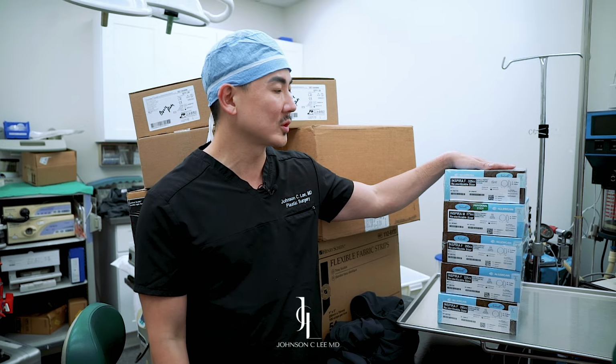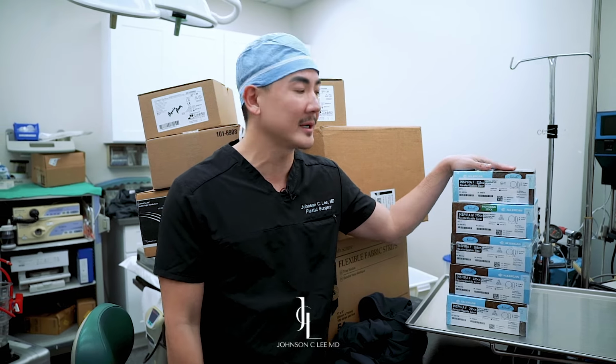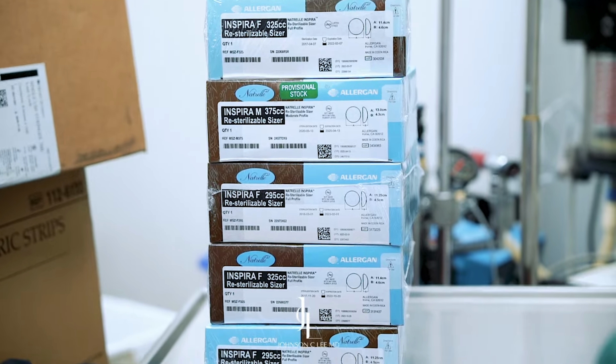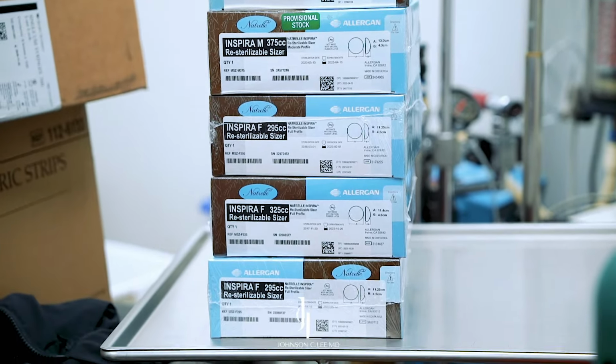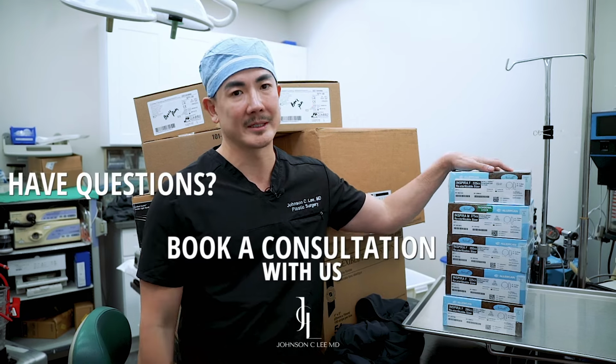In that case, during the surgery, on top of that, I also use a sizer. A sizer is a temporary implant. They come in multiple sizes and I can just use them, put them in the breast, have the patient sit up, make sure it's the right size before I put a permanent implant into the patient.